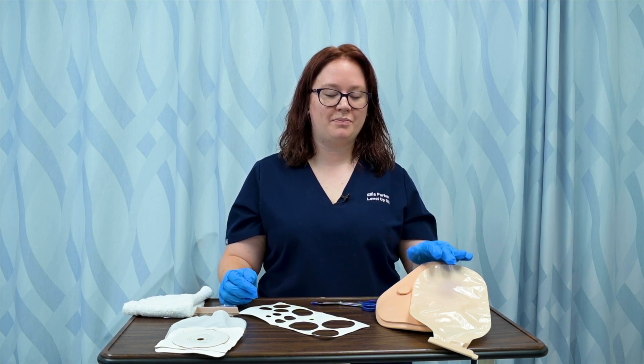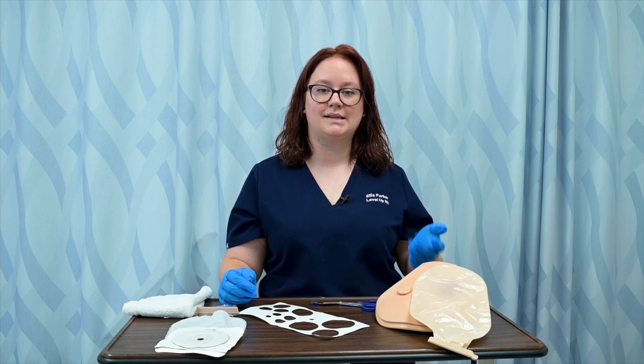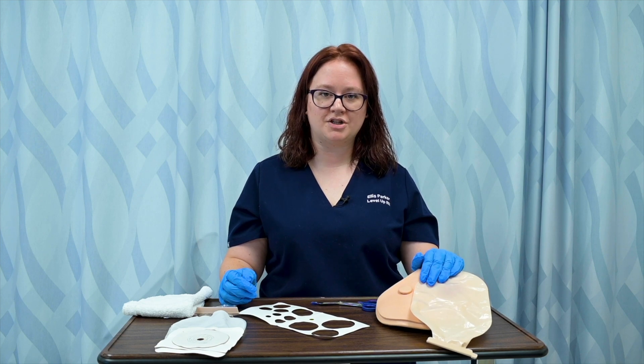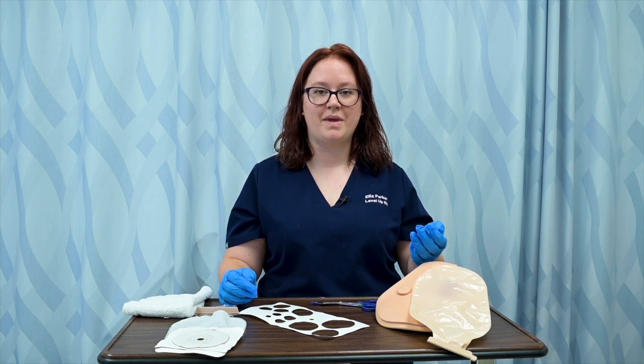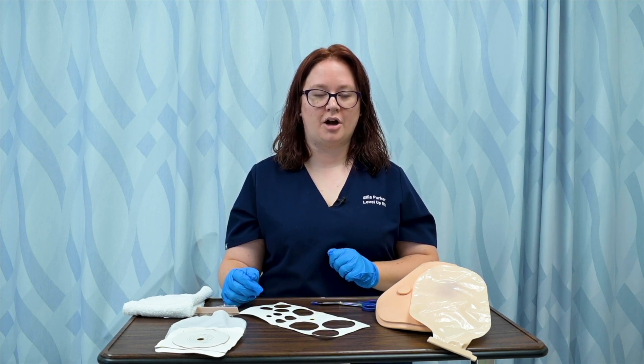You will always need to measure a patient's ostomy as they've had it for some time and their ostomy settles. It is usually the same size, but especially when a patient's ostomy is new, it is liable to change sizes with inflammation and settling. So we're always going to be working with our measurement tools.